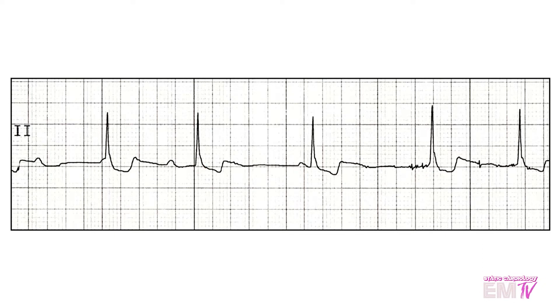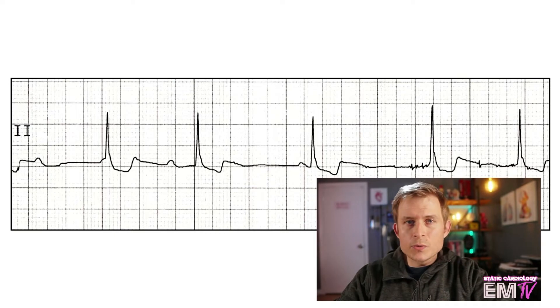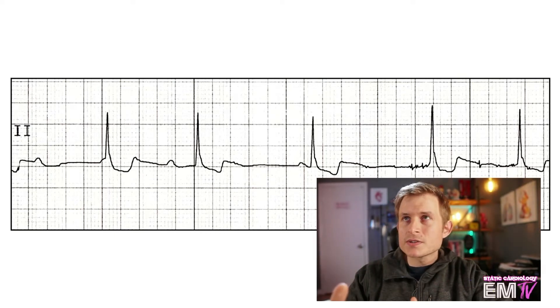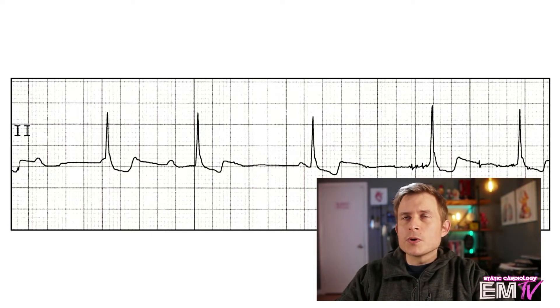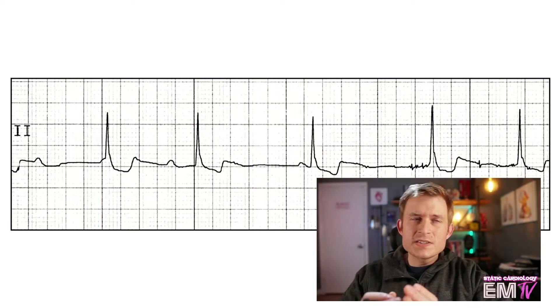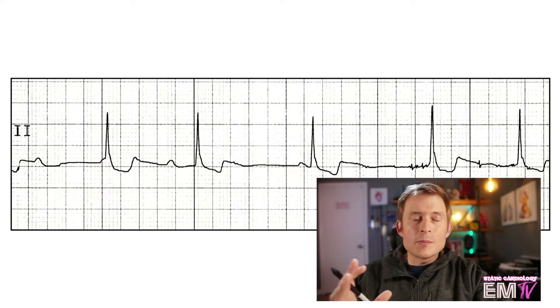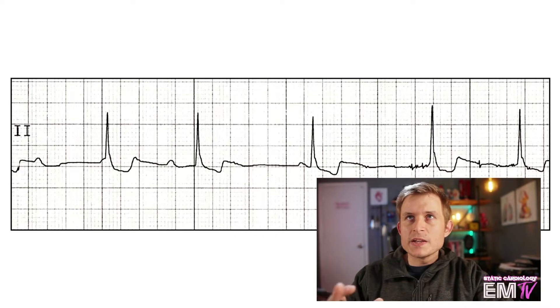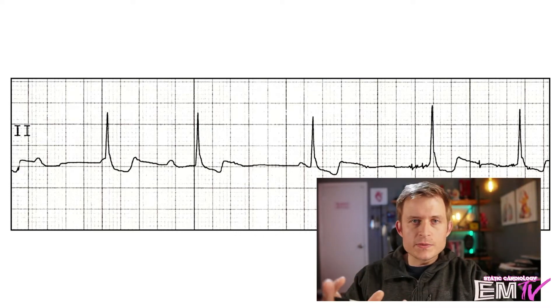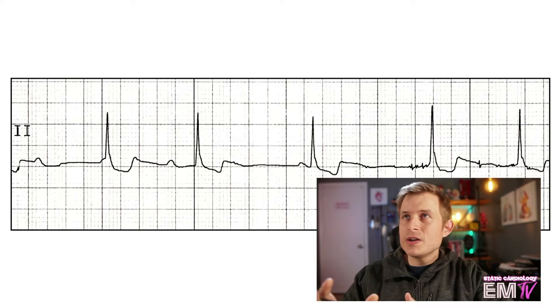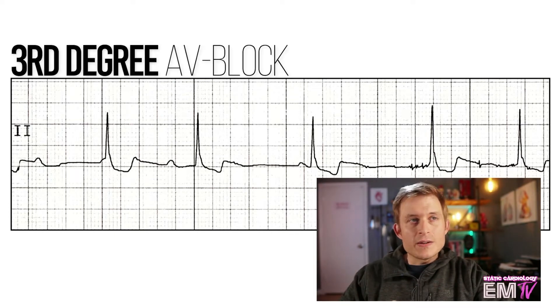So this rhythm looks very confusing. You have an inconsistent R to R interval, which would paint the picture of a fibrillation. You have a narrow QRS complex, and then you've got these P waves that are just kind of superimposed wherever they want. But because I still am seeing P waves, I'm going to lean away from saying it's atrial fibrillation and actually more toward a block. Because of this inconsistent PR interval and the fact that there doesn't seem to be any real semblance of association between your P waves and your QRS complexes, this really only means it's one thing. My diagnosis here is actually going to be a third degree AV block.